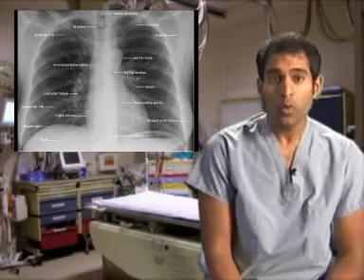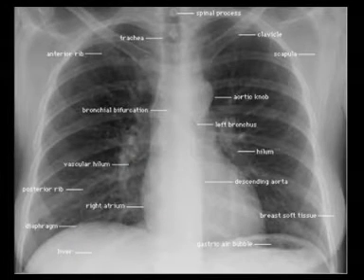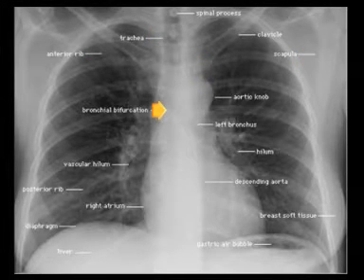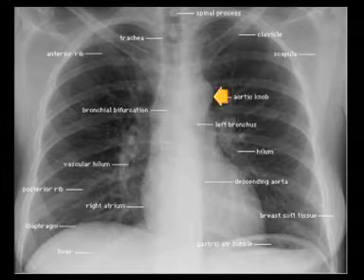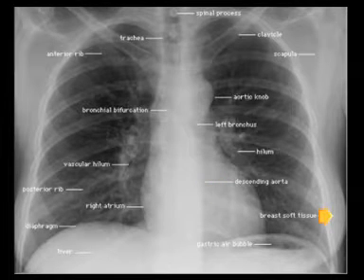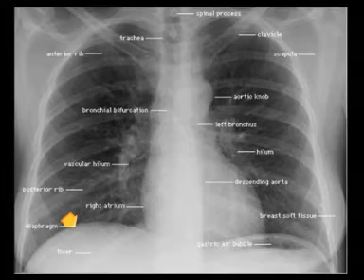The chest radiograph can show multiple anatomic pathology. As listed here, one can see the spinal column, the trachea, the clavicles, scapula, the ribs, the bronchus, as well as the carina, the aortic knob, the pulmonary hilum, the descending aorta, and certain soft tissue. Also very importantly, the diaphragm and the superior aspect of the intestinal contents.